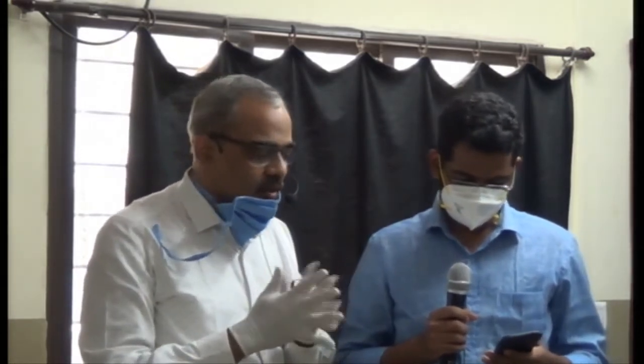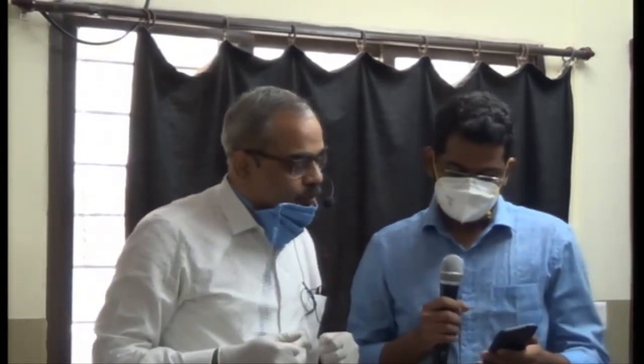It is not mosaic pattern actually. The collaterals are veins, and veins when they get dilated, they become tortuous. And as we had seen in that hepatic artery demonstration, tortuosity can give that appearance of red blue pattern due to the undulating pattern of that vein. Then we can increase the PRF or check the angle and get the sample from where it is required to take. So one more question is there.